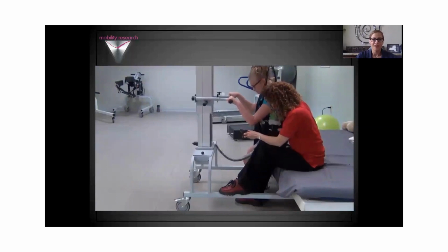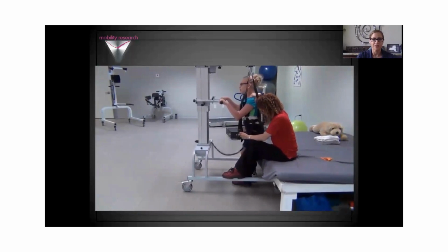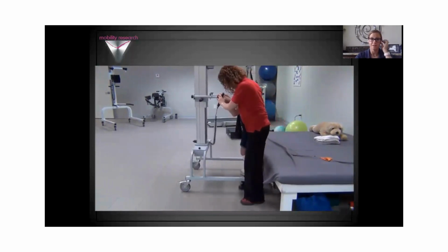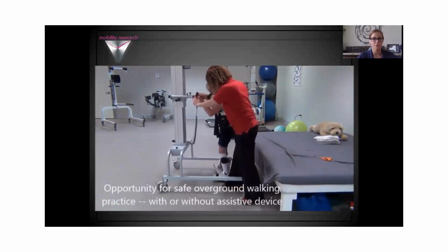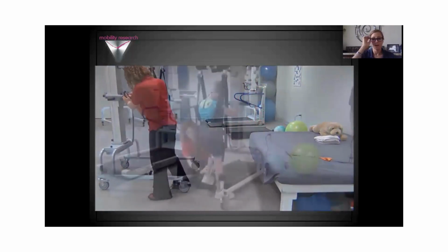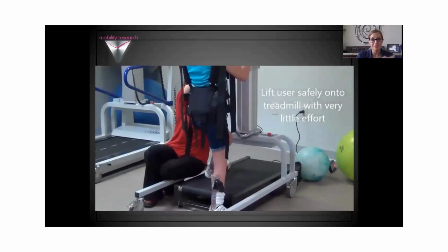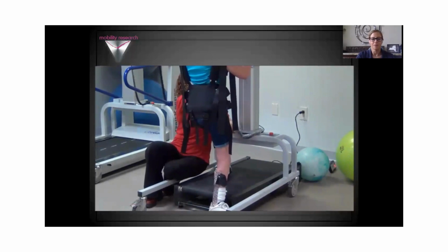Here's an example in a kiddo of utilizing the LiteGait to lift her into a standing position. So again, for a lower functioning patient who doesn't have the ability to stand from a seated position, the LiteGait can do the work to lift them into standing all the way up to 500 pounds, which our biggest model supports. And then they can work on some overground walking, or they can decide to go up onto the treadmill. Again, she doesn't need to have the ability to step up onto the treadmill. She can be lifted up using the support of the LiteGait device.